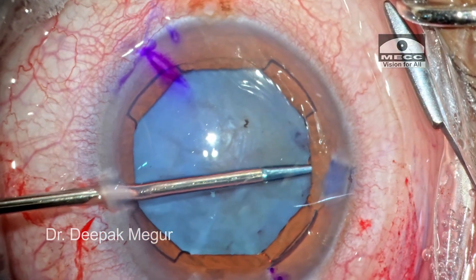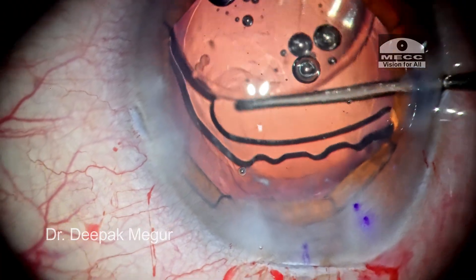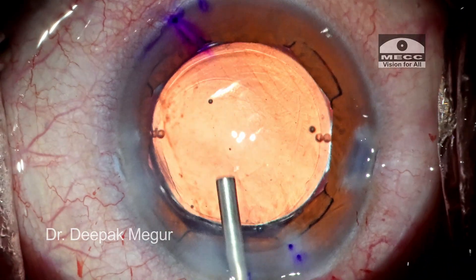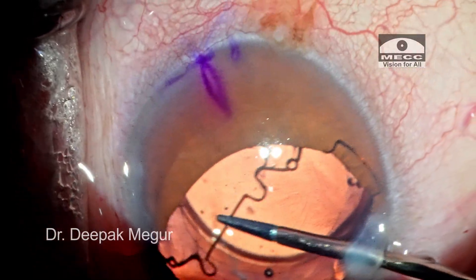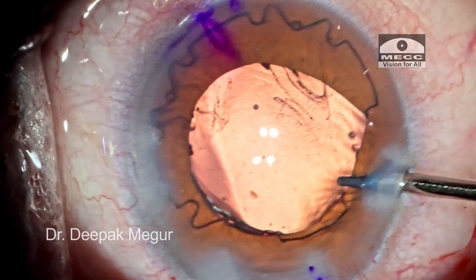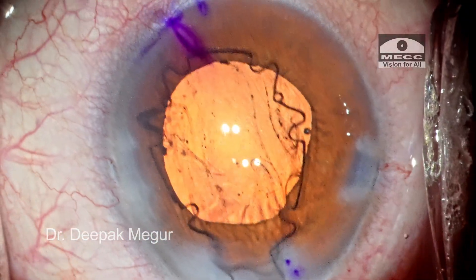The B-Octa insertion is complete and simple. We now have a very well-dilated pupil. The rhexis is done, nucleus is emulsified, and the IOL is placed in the bag. Time to explant the device. The device is removed under OVD — the forceps goes through the side port, holds the device, and disengages all the notches. The forceps is then pulled out through the main incision, holds one of the flanges, and the device is pulled out.